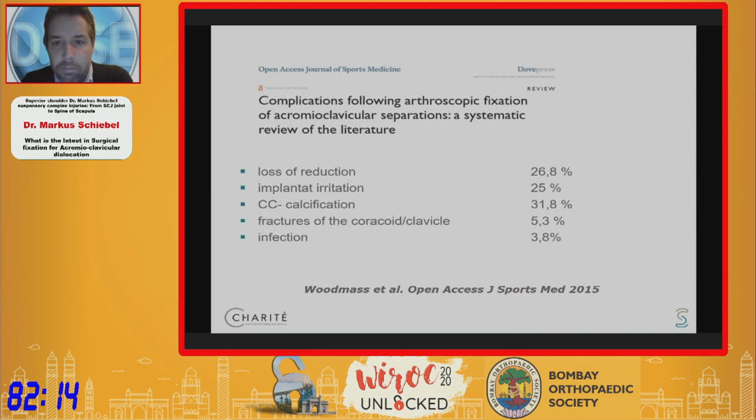So in a substantial cohort, you might have to remove these implants due to pain over the superior aspect of the clavicle. And this should not be the case, since these implants are designed to be implanted for a single operation, compared, for example, to a hook plate.